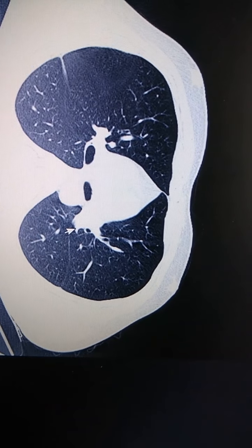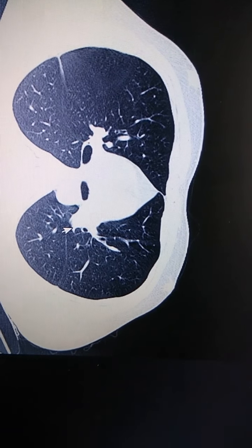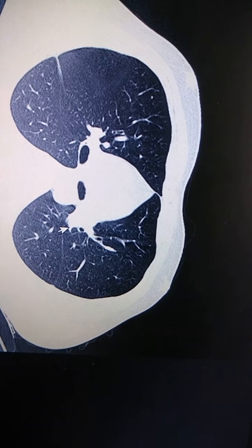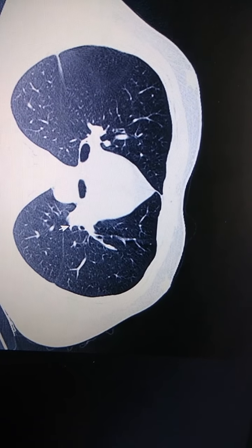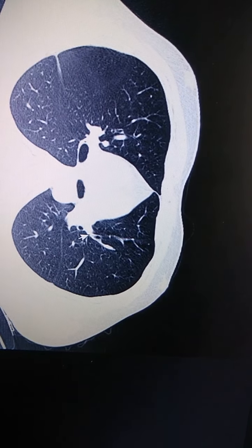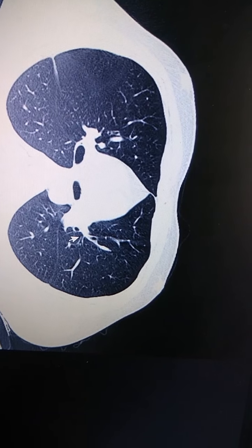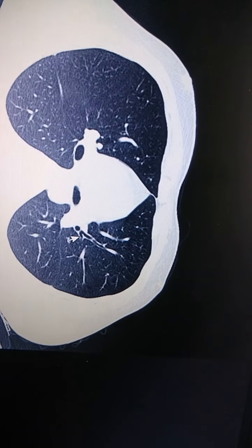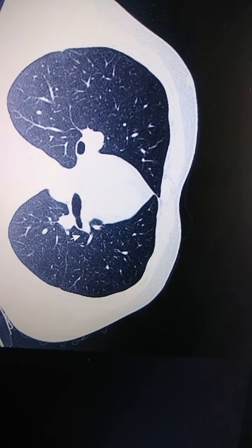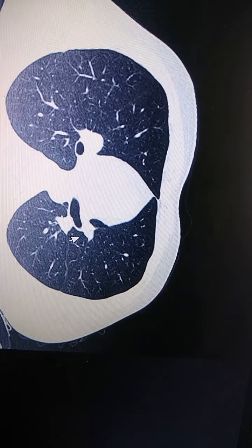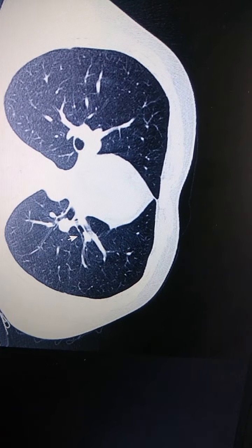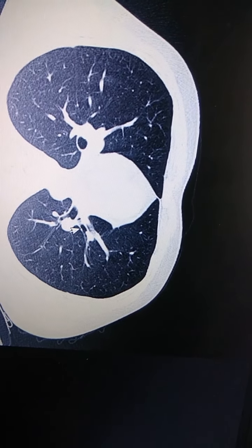As you all know, the left upper lobe has 4 segments: apicoposterior, anterior, and 2 lingular segments. As you can see, this is the apicoposterior segmental bronchus and this is the anterior segmental bronchus. As we scroll down, they both join together. Scrolling down further, you can see this is the lingular segments.